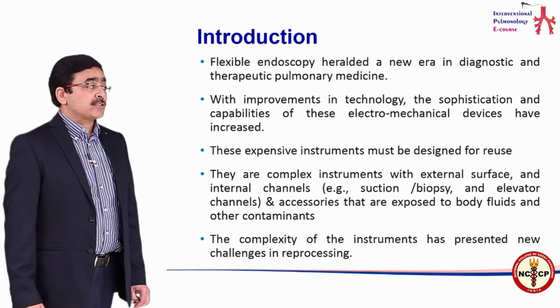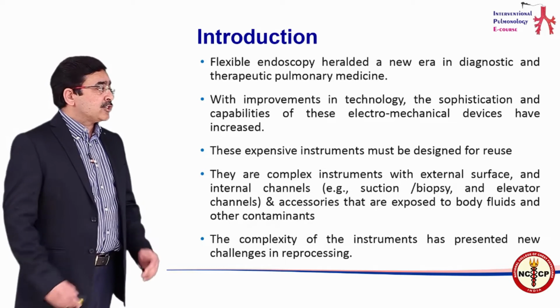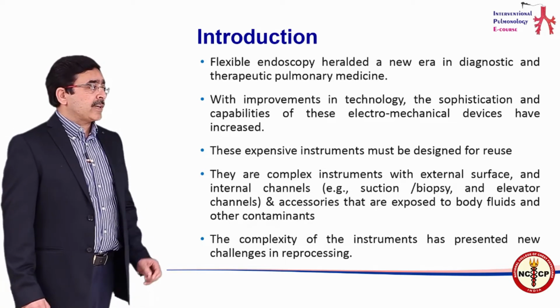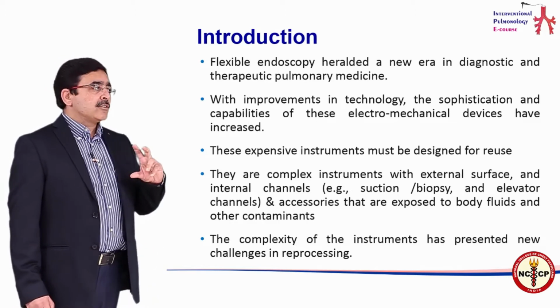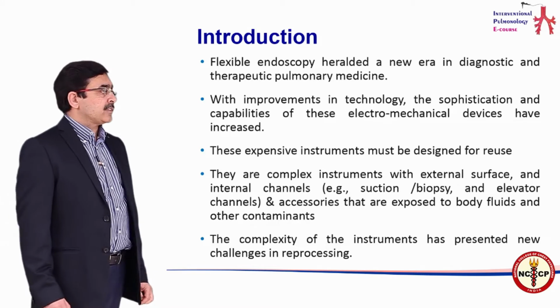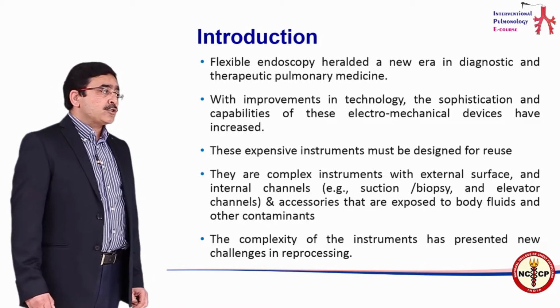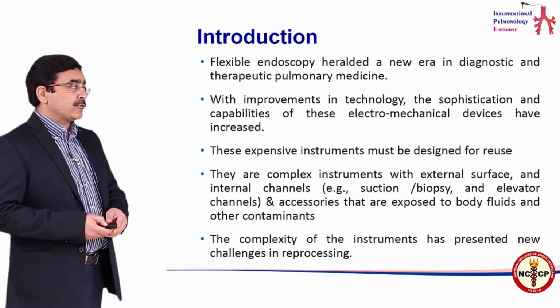These are complex instruments with external surfaces and internal channels which are utilized to take suction and biopsies, and there are certain channels which change the position of the scope, which are called elevator channels. So these complex instruments need to be cleaned properly because they have to be reused.